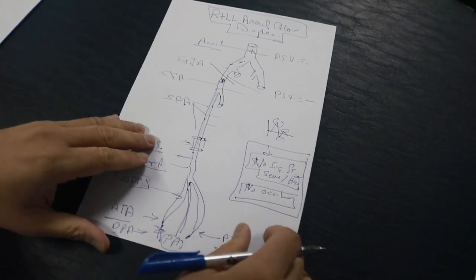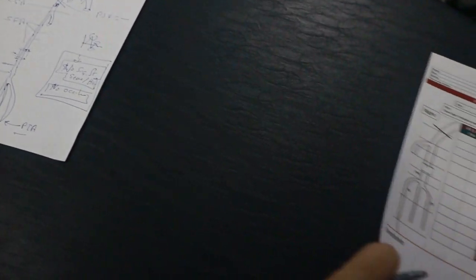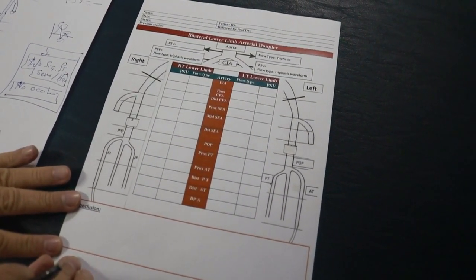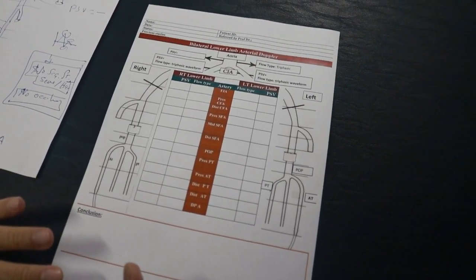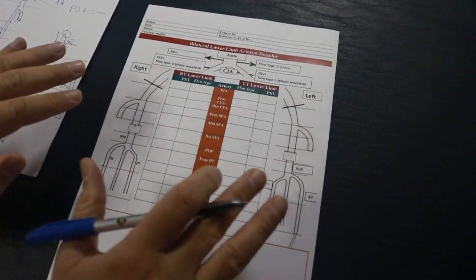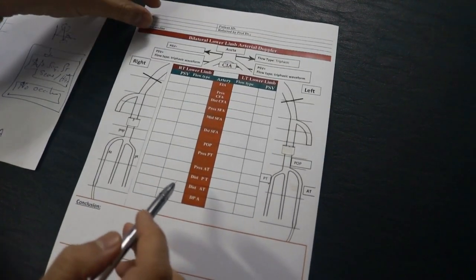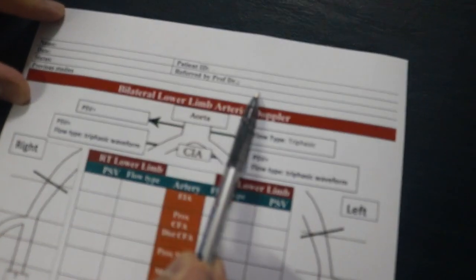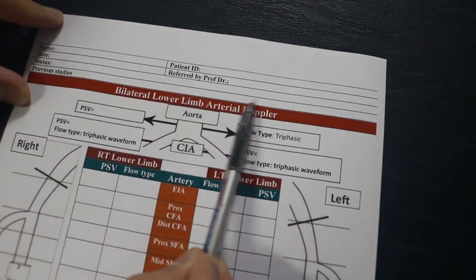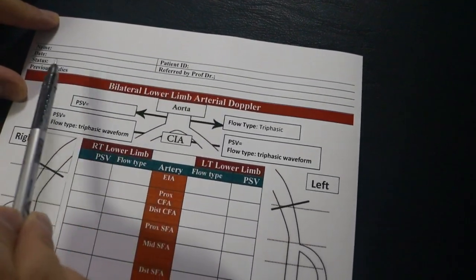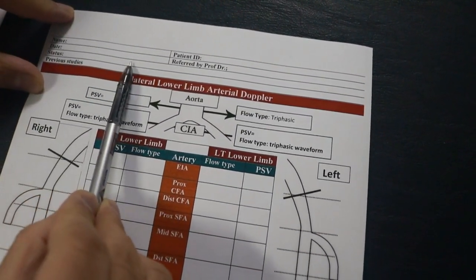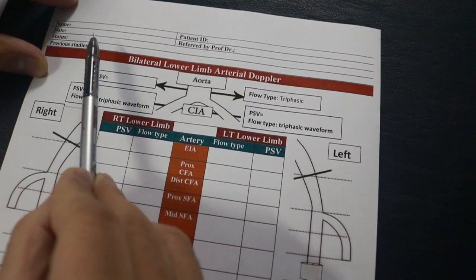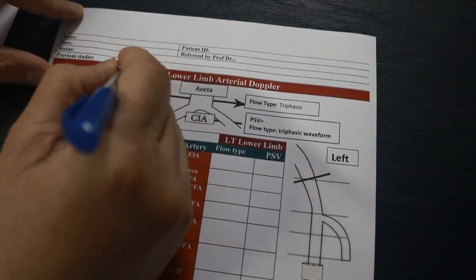Let us go directly to a format dedicated for arterial lower limb doppler study. The case we did, I need to report it in this format. First of all, remember that the name, patient ID, date and referred by status, previous studies. This should represent a new report. The patient is complaining of according to the clinical data, then previous study if there is, or no previous study.